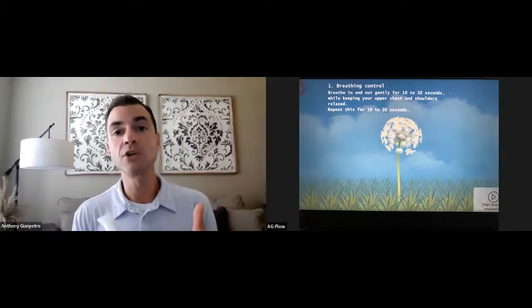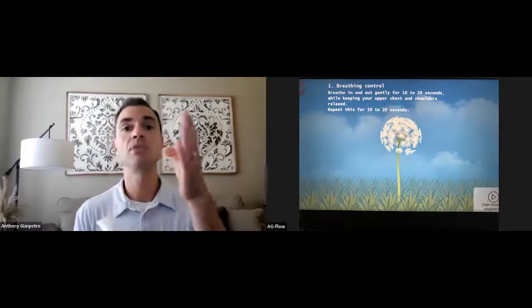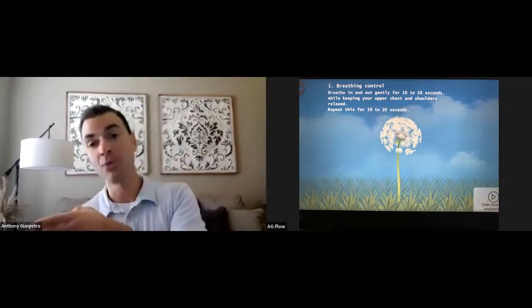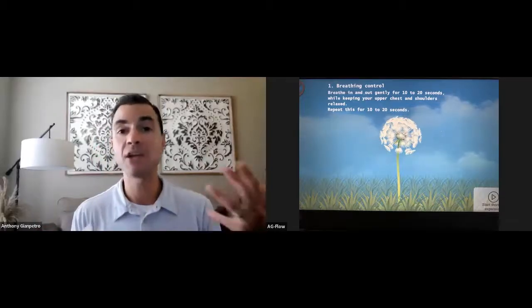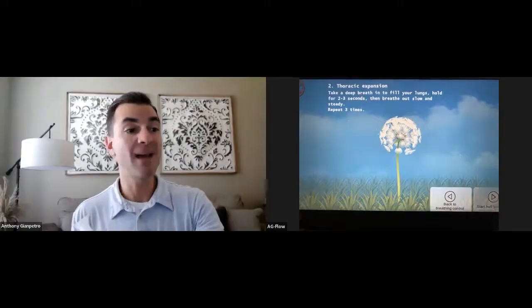There are some researchers out in the UK who use this technique successfully by advocating for step 1, step 2, step 1, step 2, step 1, and then step 3 to breathe out. So you can mix and match this as you need, but it can really be as simple, if you wanted to, as going to step 3 and just seeing if they can clear their airway.